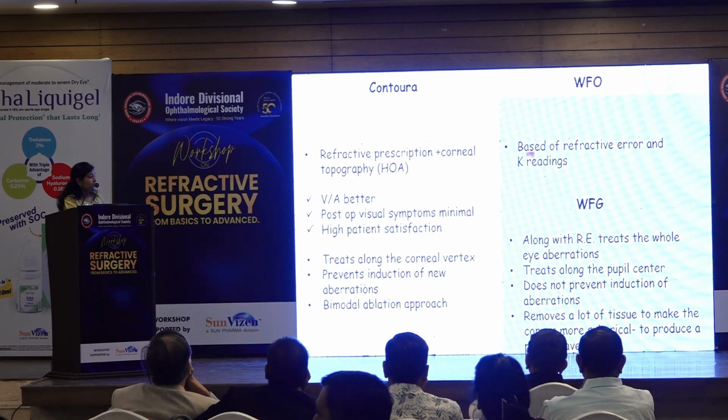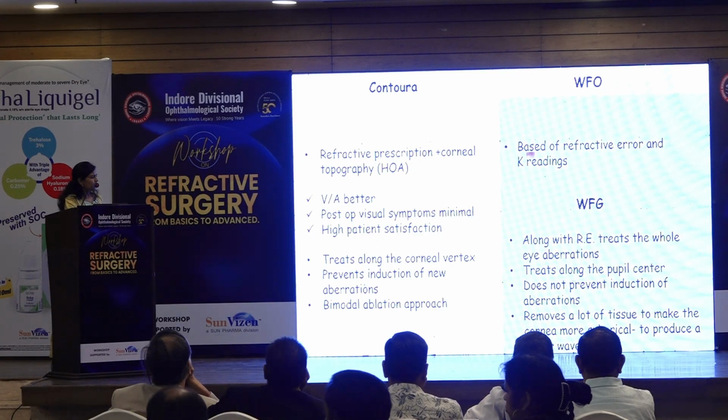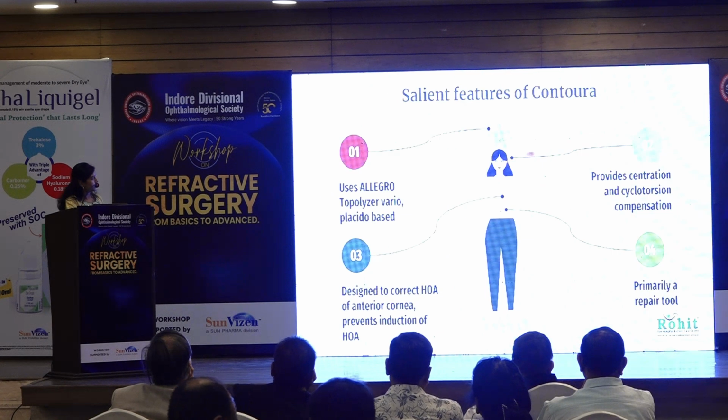But wavefront guided did not prevent induction of new aberrations and was treated along the pupillary center rather than the corneal vertex. Also, the removal of tissue was a lot more in wavefront guided as compared to Contoura because of the bimodal ablation approach of Contoura.